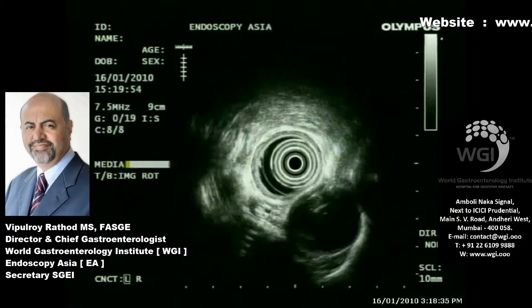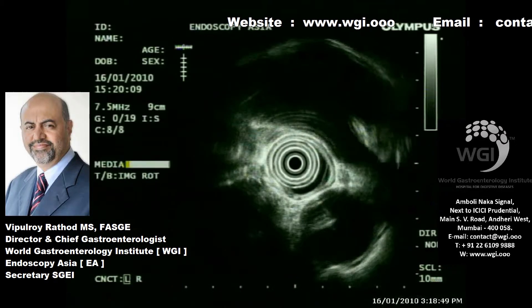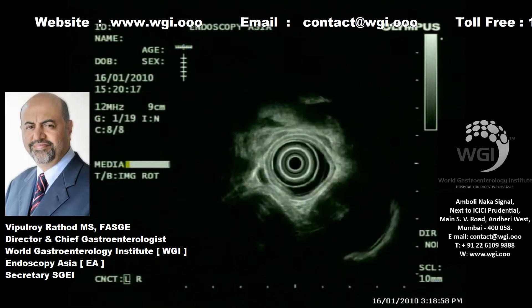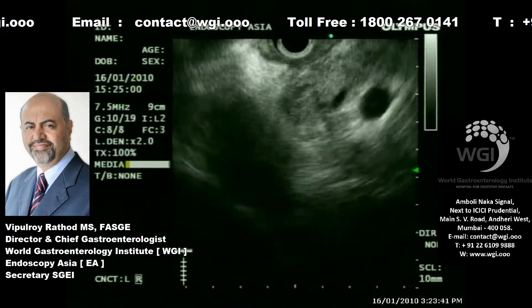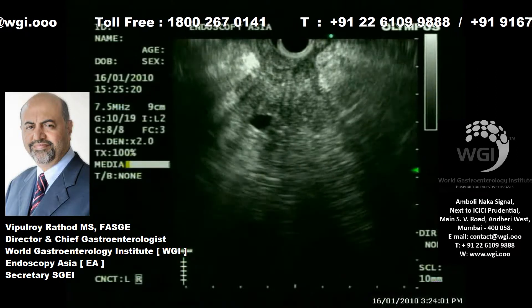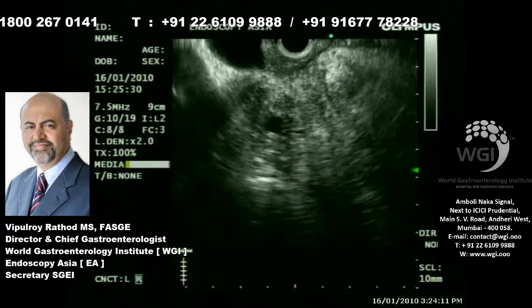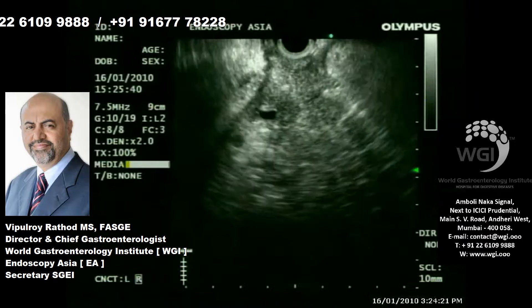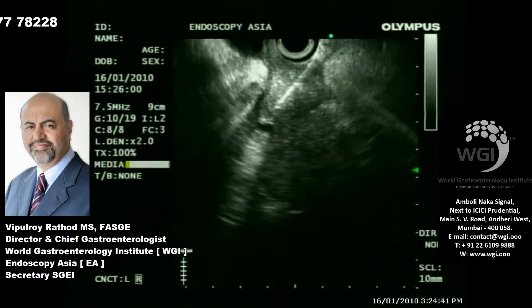You can see the aorta at the 5 and 6 o'clock position — that is the standard position we maintain for mediastinal evaluation. As I withdraw, I am seeing sub-centimeter lymph nodes in the supra-diaphragmatic, subcarinal, peri-esophageal, and peri-aortic region — round hypoechoic nodes. We need to look into this science of staging any pancreaticobiliary cancer before definitive treatment. Tumors deemed resectable on conventional imaging, including PET-CT scan, should undergo endoscopic ultrasound prior to definitive resection, as you may pick up small lymph nodes that influence staging and eventual outcome.